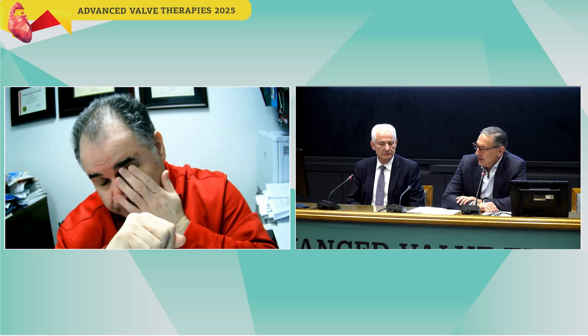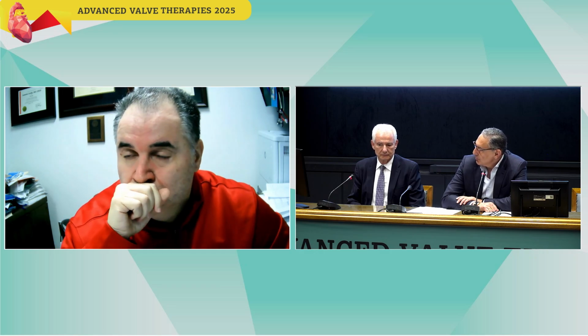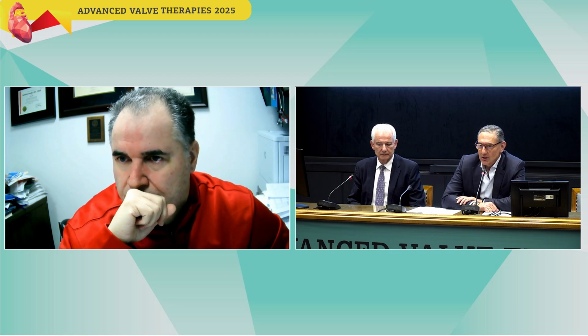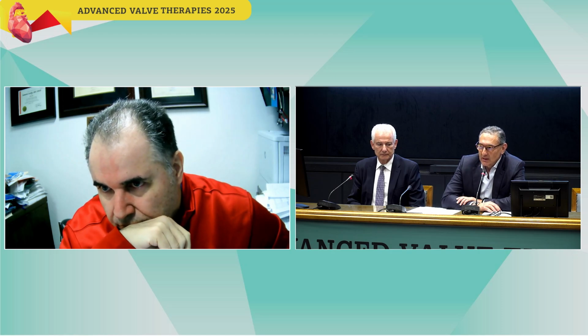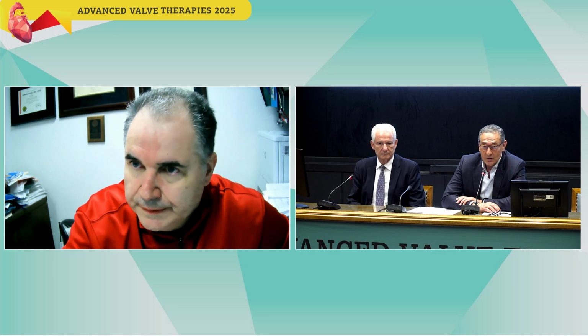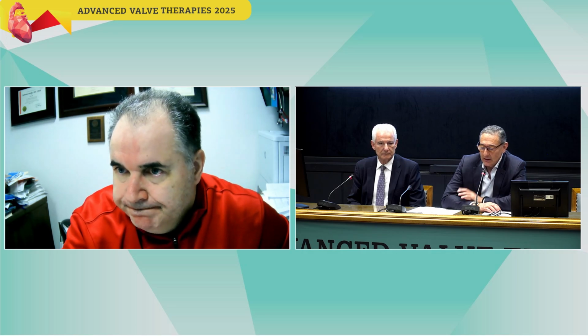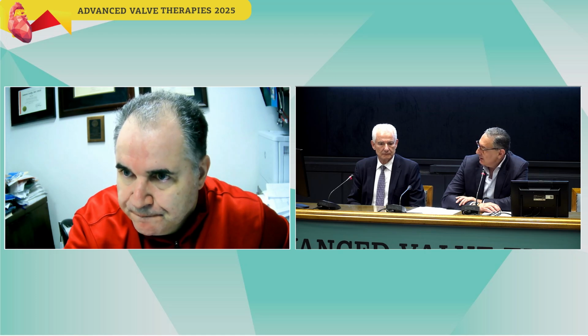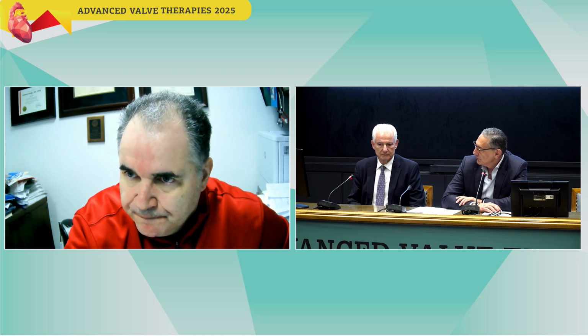Now, the heart is stopped in an end diastolic position with the cardioplegia. But we don't take into consideration so many other aspects of the system of the mitral valve, the heart, and the patient around it. That means if we have a 25-year-old patient with a measured size in cardioplegic arrest of 30 millimeters, we will ask the nurse, unpack a 30-millimeter heart valve.